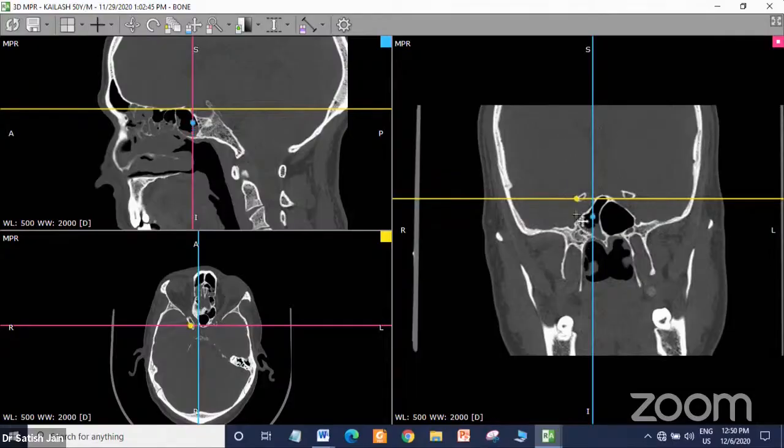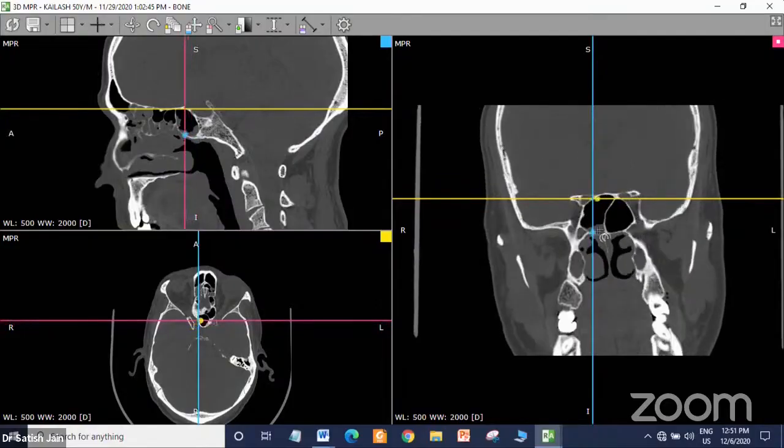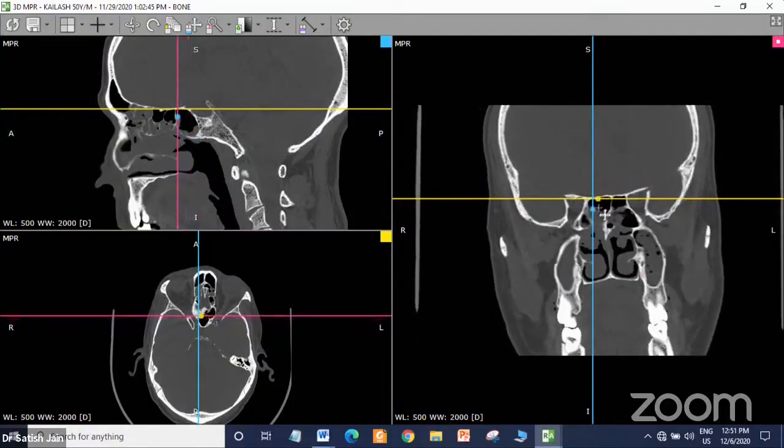This V2 comes from the floor. See the opening. It comes from the floor of the middle cranial fossa as a branch of the trigeminal, and just above is the temporal lobe. And when we drilled this pterygoid, I showed you the dura. That is the level of the dura there. This is how tumors from here easily spread to the temporal lobe. You see the angiofibromas, many malignancies, and even the mucor spread to the temporal lobe right from here. So this pterygoid is a very important anatomy, not in sinus surgery, but in other surgeries, and then behind is the sphenoid sinus with minimal opacification.